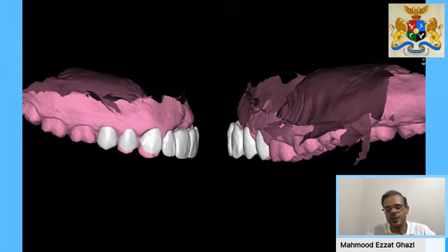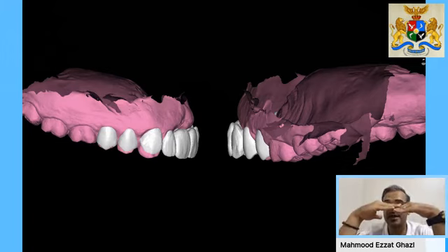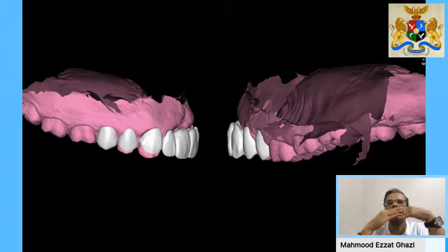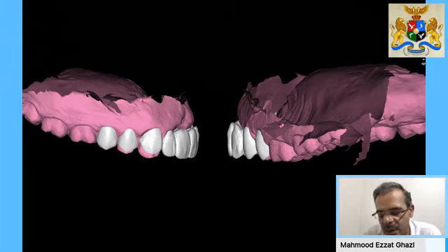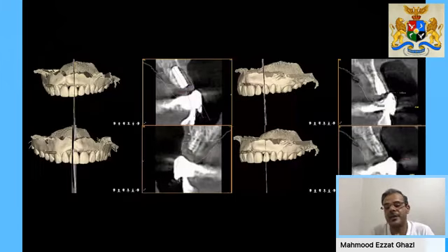We brought the soft tissue and the bone to a higher level, meaning we reduced the bone vertically so that it's above the upper lip level, so that the demarcation of the prosthesis is hidden beneath the patient's upper lip while the patient is smiling. At the same time, we regenerated bone and soft tissue horizontally so that we could have a flat profile, so that our prosthesis could rest on that flat profile, and it would be much easier for hygiene and for biological principles. So it's a totally different way of thinking.